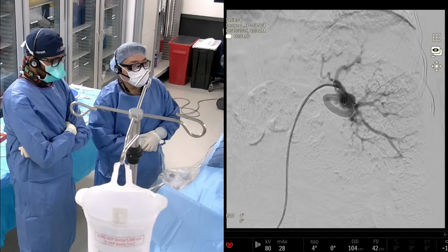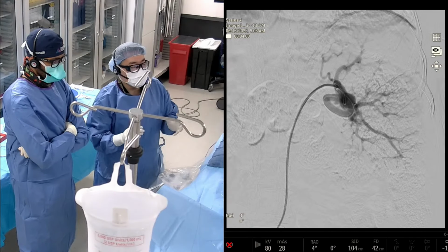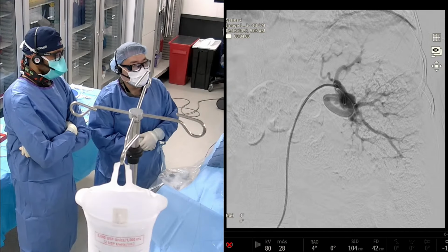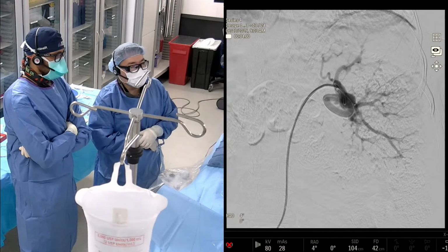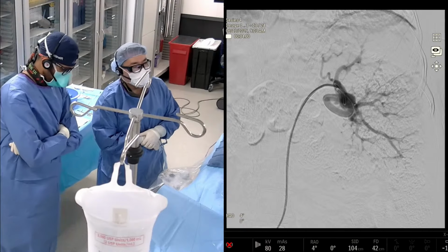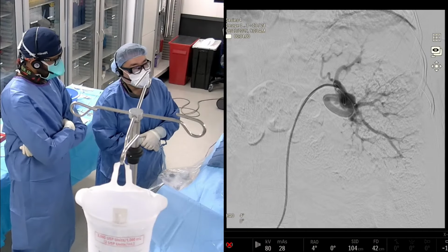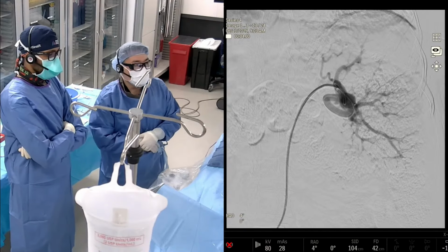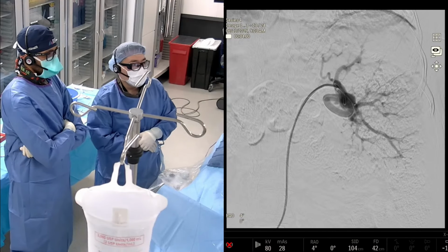So we didn't want that to be limiting once we're using our microcatheter to get in. Obviously, we can also do runs through the guide, but we wanted to have access through the microcatheter as well. It's a 1200 psi. We can do up to even 4 cc's per second through it, but we did a 3.5 cc per second injection once we were in the aneurysm.